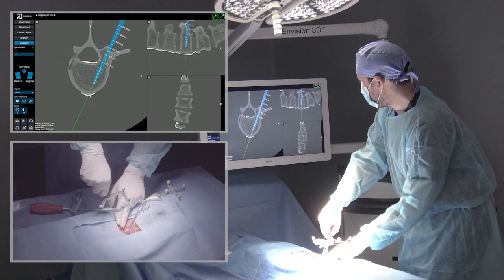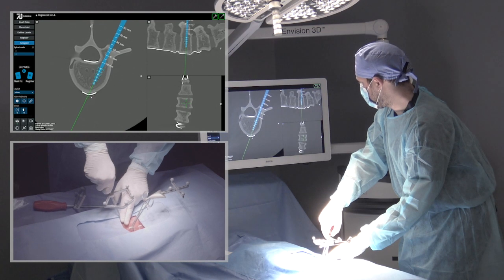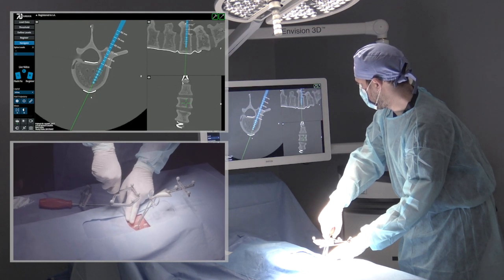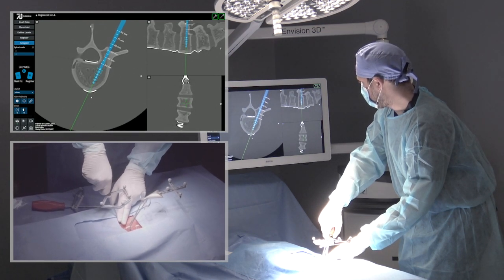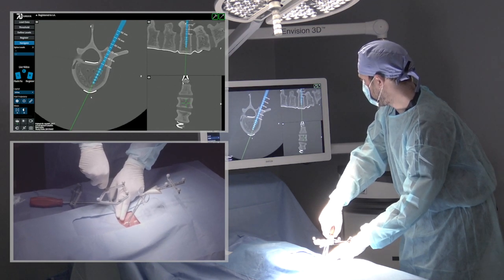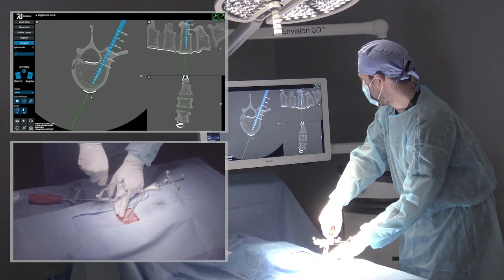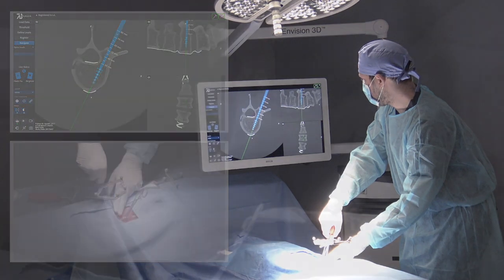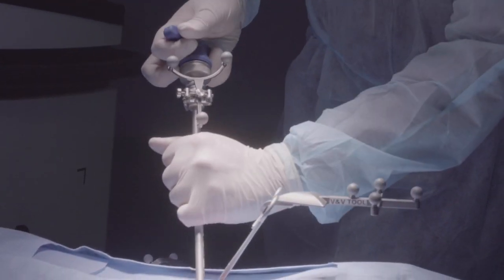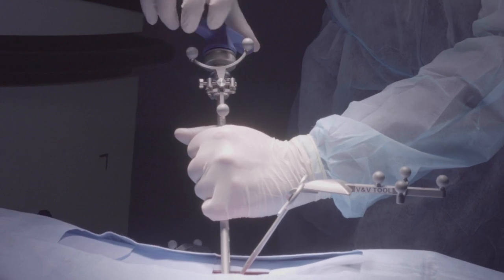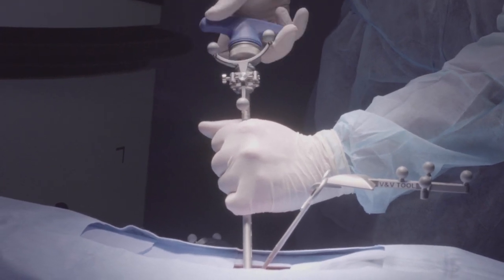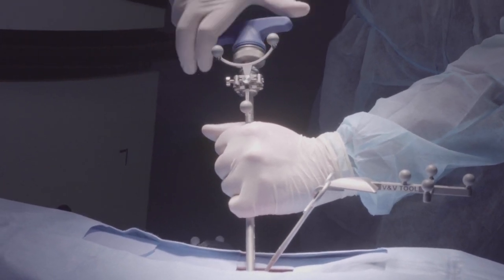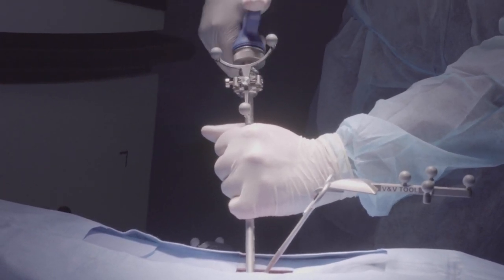Notice that the overhead tracking cameras coupled with 7D's unique sphere geometries eliminate the line of sight issues common with older technologies. Any rigid instrument, such as a tap or a screwdriver, may be tracked using 7D's clamp and array system.